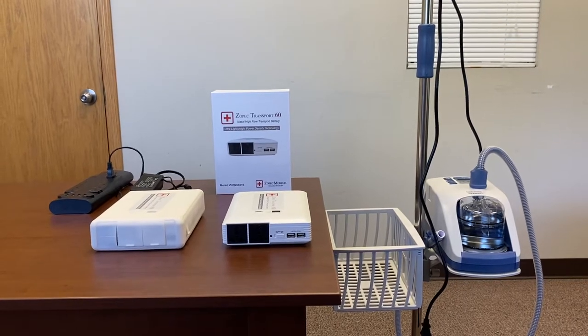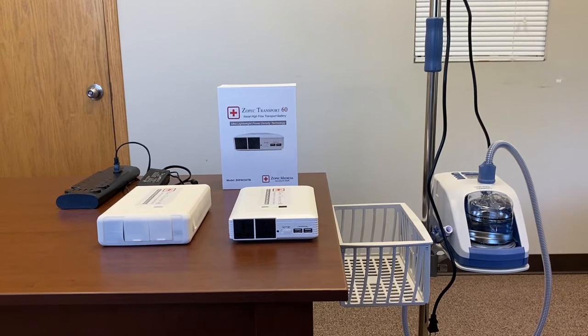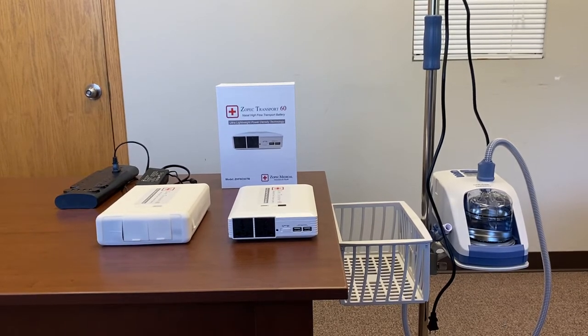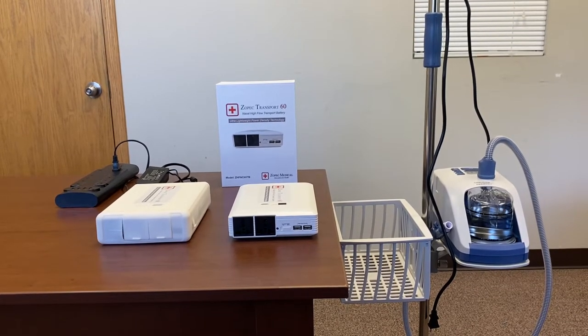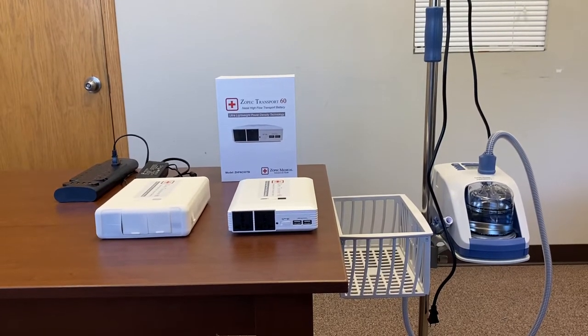Hi, this is Strong from ZOPEC Medical. This video will demonstrate how to use the ZOPEC Transport 60 battery for nasal high flow transport in everyday applications as well as for air ambulance.